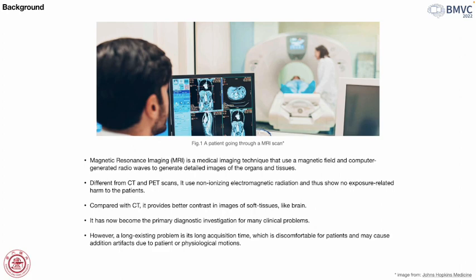However, a long-existing problem is its long acquisition time, which is uncomfortable for patients and may cause additional artifacts due to the patient or physiological motions.